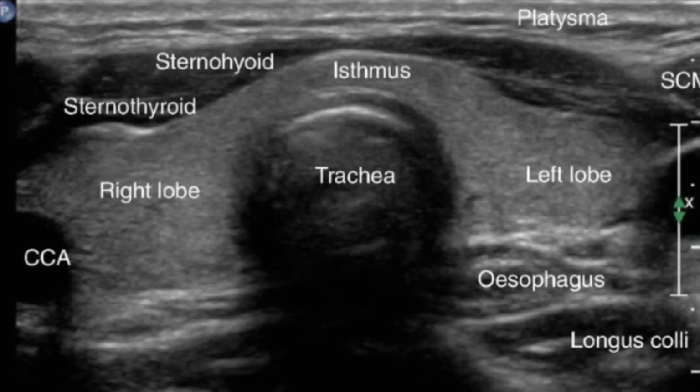In the view, you can see towards the medial inner wall the carotid vessels, and towards the outer lateral side you can see the jugular vessels. On the top of it, you can see another muscle, which is called the sternocleidomastoid muscle. So these two are very important landmarks.